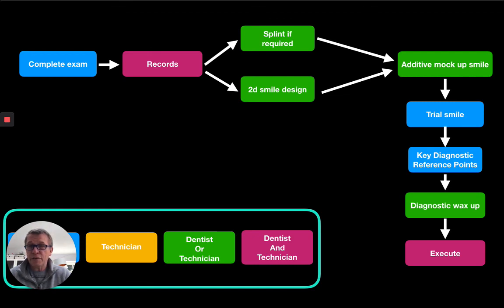We've been getting a lot of great patient buy-in to this. They really like the way we're presenting these cases now. I'll be honest with you, we did it in the analog world, but it was that middle ground where you really need that 2D and 3D smile design. For those of us who've been doing it a while, maybe got a bit of a reputation, maybe there wasn't much of a problem, but I think for a lot of people out there, trying to communicate the worth and the value of that has been very, very difficult.